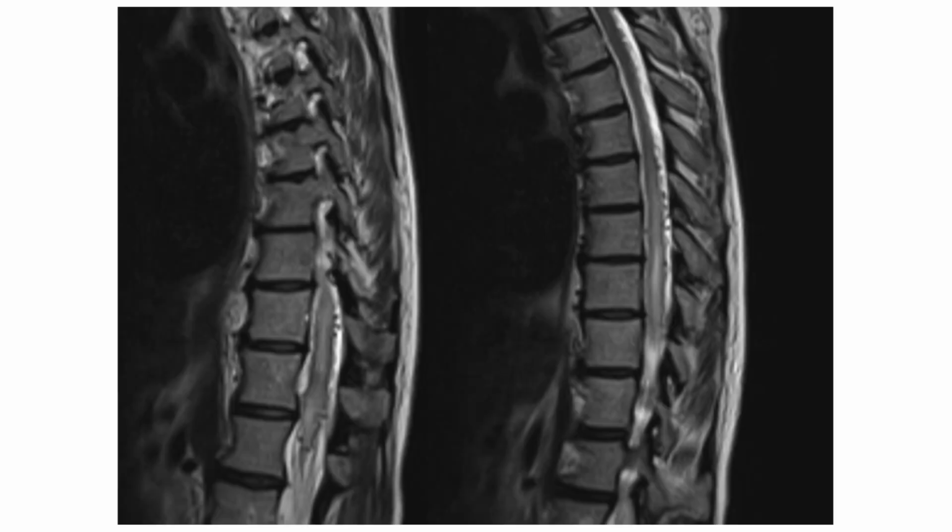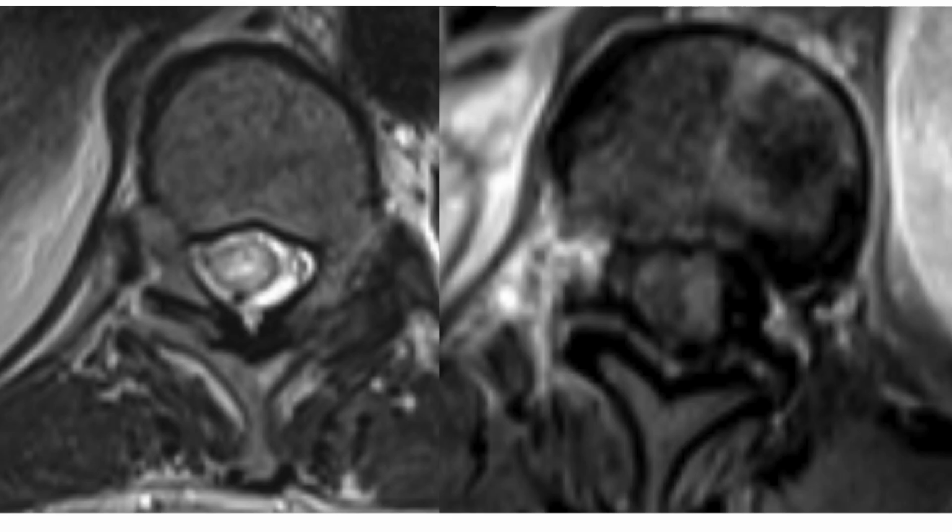Sagittal T2 weighted MRI demonstrated high signal in the conus as well as multiple flow voids along the dorsal and ventral aspect of the cord. On the axial MRI, you can see the high signal within the cord as well as the engorged vessels in the coronal venous plexus. Also, on the post-gadolinium MRI, you can see geographic areas of enhancement within the cord itself, consistent with a missing piece sign, which has been described in cases of congestive myelopathy.